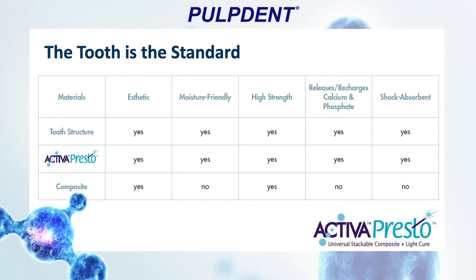But when you look at traditional composite resins, yes, they're aesthetic, but no, they're not moisture friendly. They have high strength capacity, but they do not release or recharge calcium and phosphate, and they don't have shock absorbency. They're very brittle.